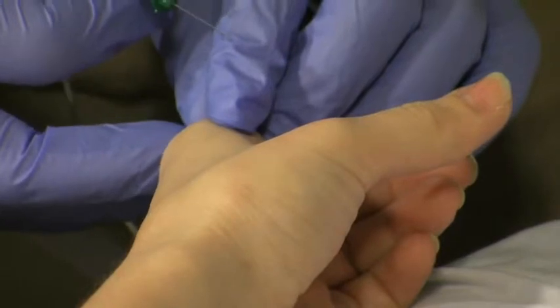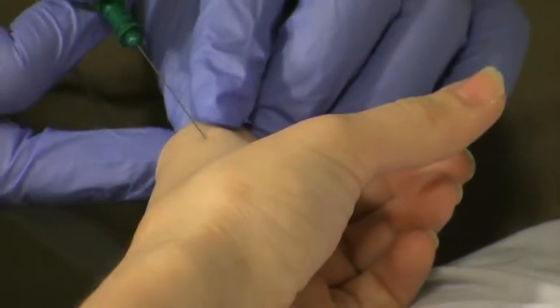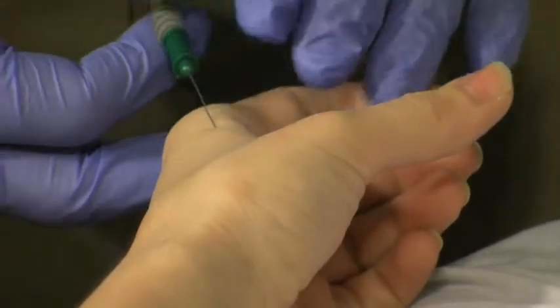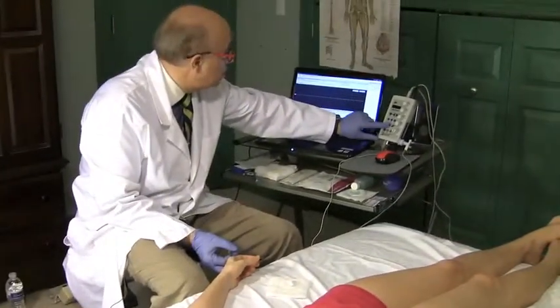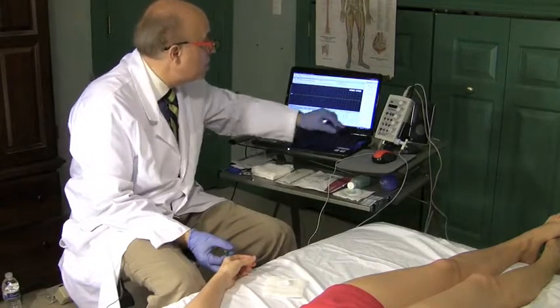The painful part is when the needle penetrates the skin. Here we go. One, two, three. That's it. And I'm inside the muscle now. Now I'm going to see the activity. So I'm turning this on here.